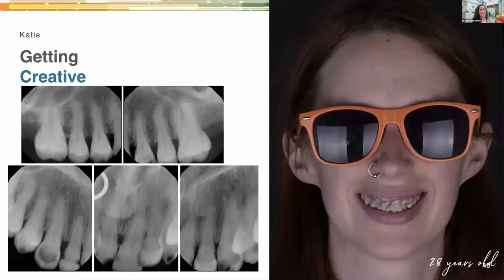My assisting team, they can tell you how to design a guard. They can tell you exactly that we're going to have equal pinpoint bilateral posterior occlusion, that we're going to have canine guidance, that the canines are going to disclude. They know that because they're doing that stuff. So it's really cool.